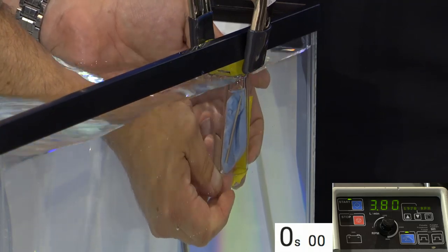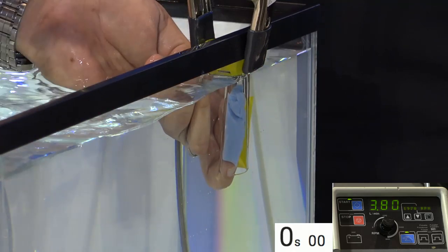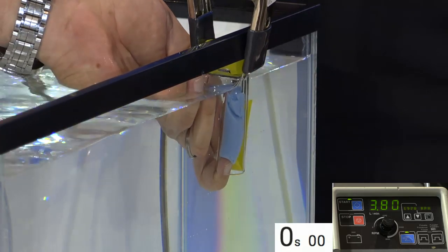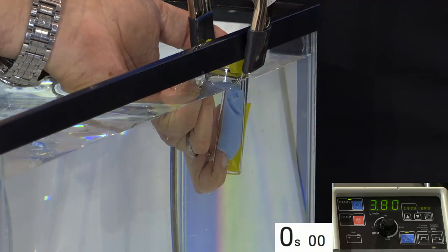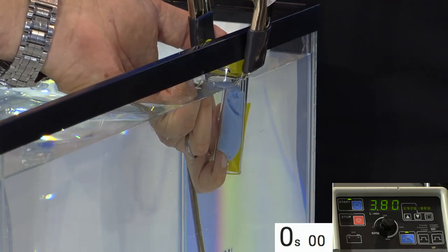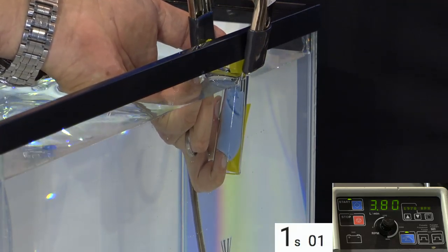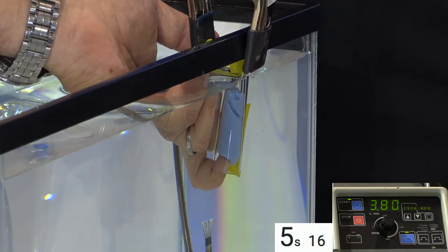I'll show you a trick that we use in just a couple of moments, but I want you to be the one to engage it so you can get started. Okay, I'm just going to leave my finger there to hold it up. This is an enormous clot. Get ready for the clot. Let's go. Yep. You getting it?